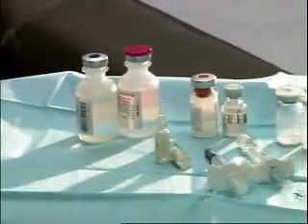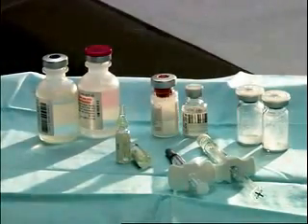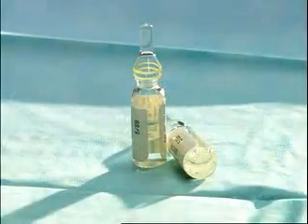You should also be familiar with the packaging of injectable medications. Injectable medications are packaged in glass vials or ampules, and some come in pre-filled cartridges or syringes. Ampules contain single doses of liquid medication. It is good practice to use a filter needle when preparing medication from a glass ampule to prevent drawing up glass particles into the syringe.